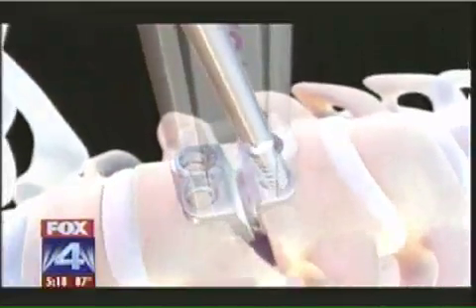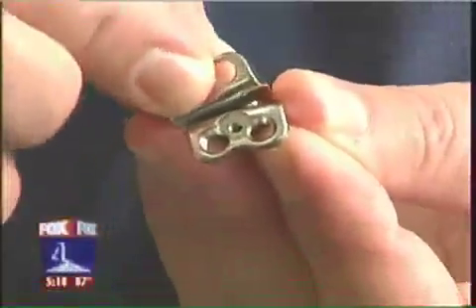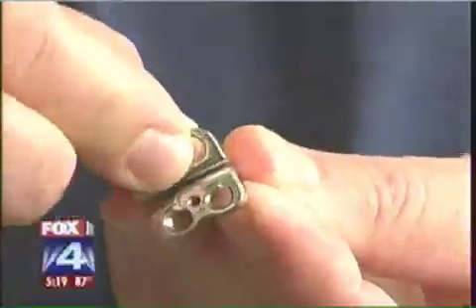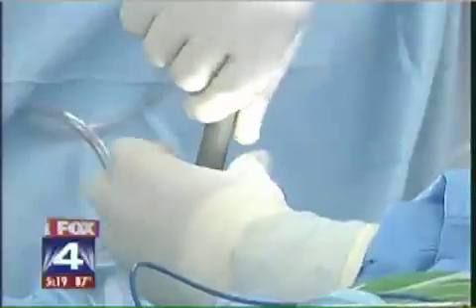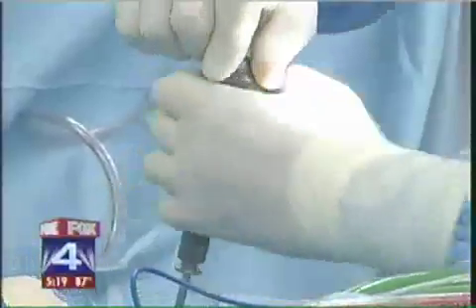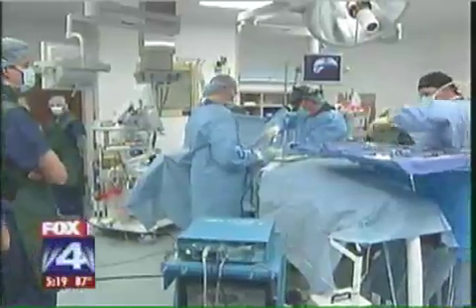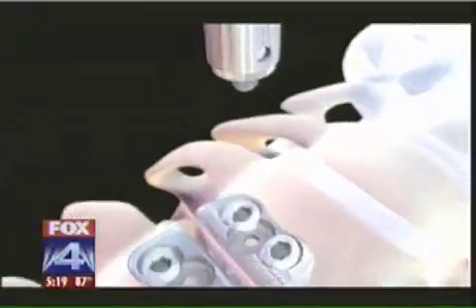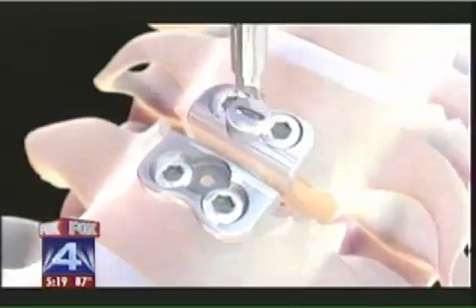The first Medtronic Prestige artificial disc was implanted Thursday. It also allows flexion, extension, rotation, and side bending, which is what the cervical spine does as well. The entire surgery took less than 2 hours, and the majority of that time was used to take out the patient's defective original disc and to clean and smooth surrounding surfaces on which the artificial replacement can be fastened.